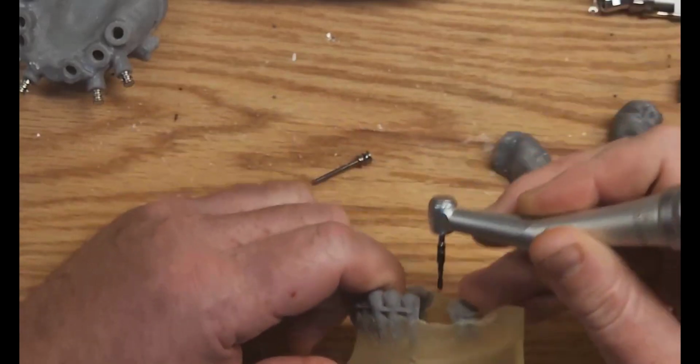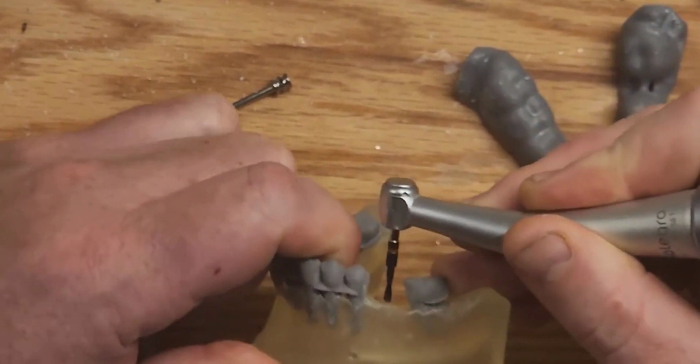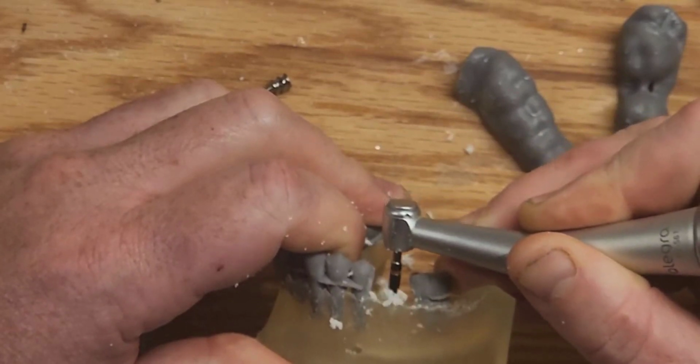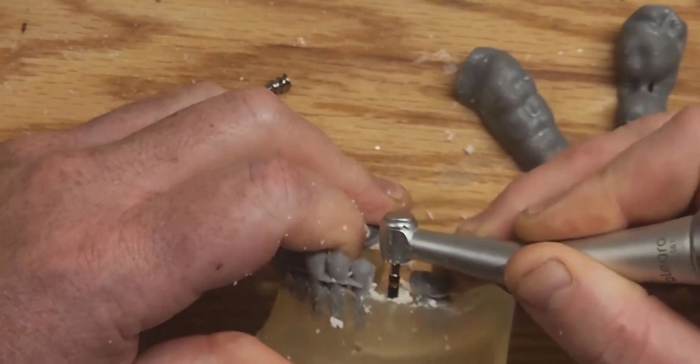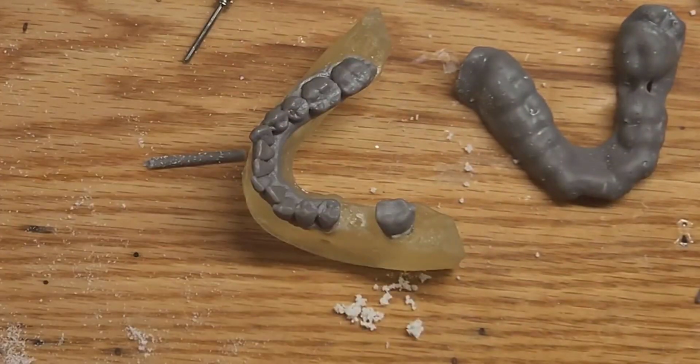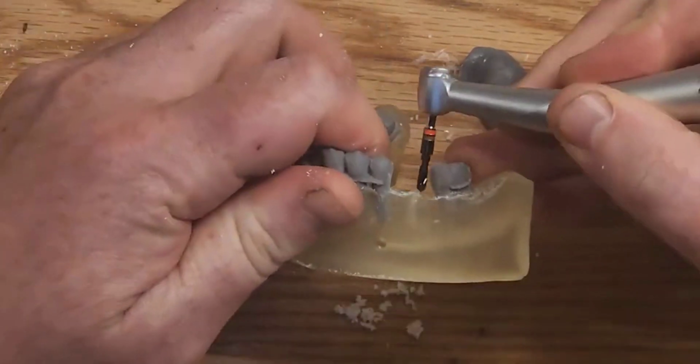Okay, here we go. Hopefully I'm in frame here. So much softer than the traditional resin. And again, this is that stuff that's kind of thermoplastic, so you wouldn't end up chewing up the drills. So now I'm going up a drill size.